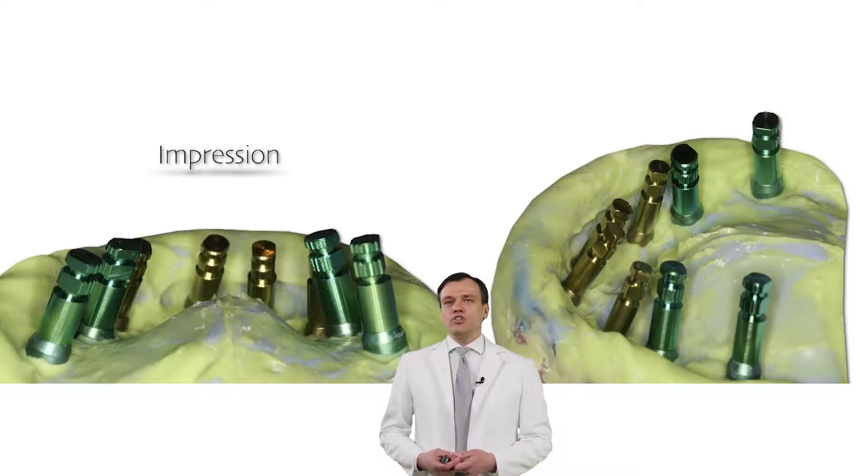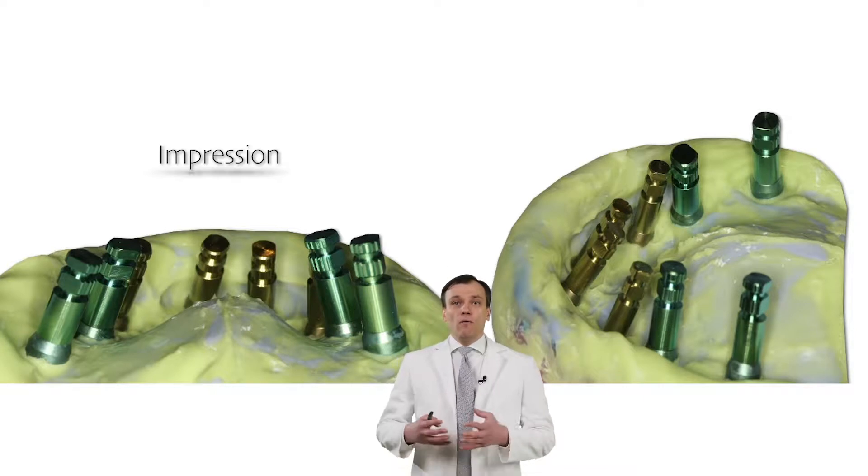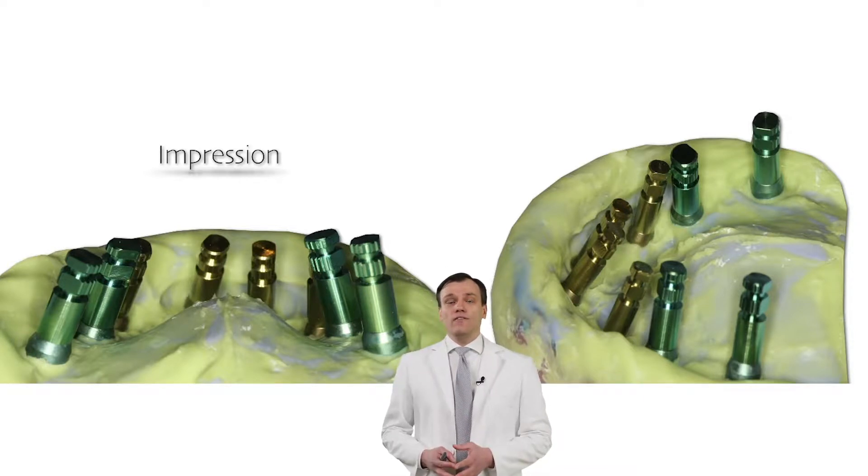I'll be using open tray transfers and a special material — one typically used for occlusal registration. But before we see the video, let me put you into some context and explain why we sometimes need to use materials other than silicones or polyethers.